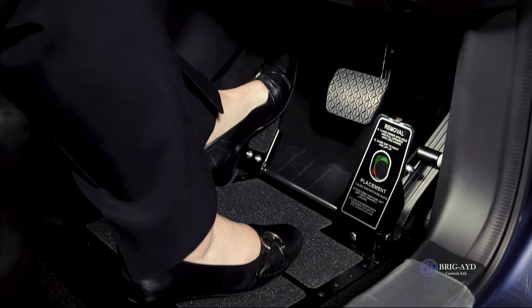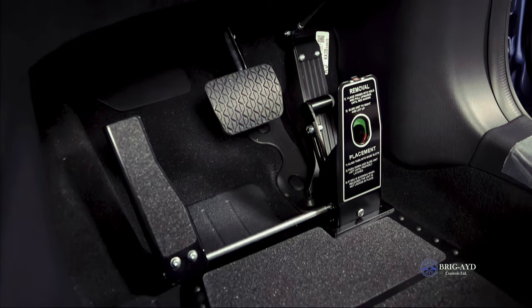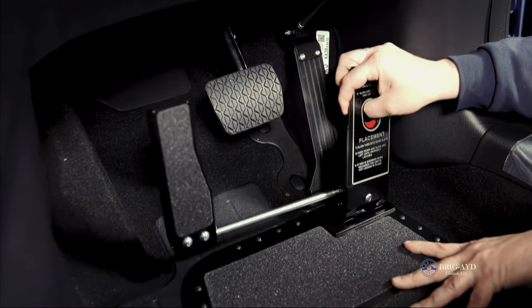A floor mounted pedal transfer provides a pedal guard to prevent accidental operation of the original accelerator. This can quickly be detached to return control to the original pedal.